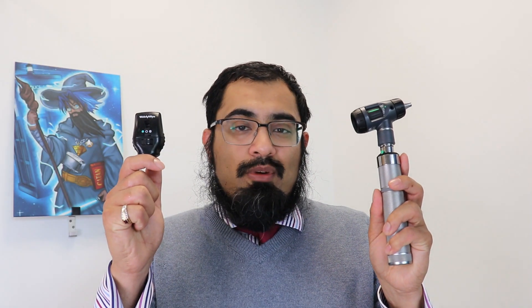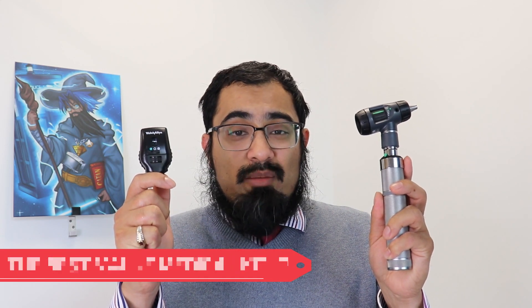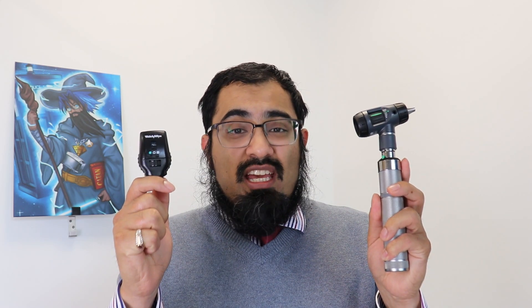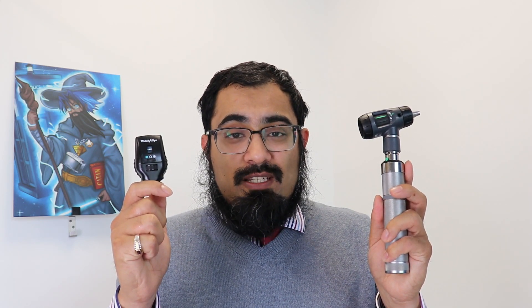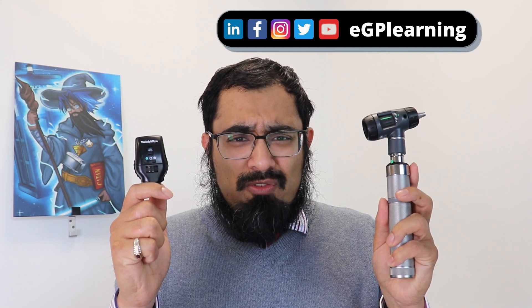The otoscope and the ophthalmoscope are easily recognised pieces of kit that most clinicians use on a regular basis. They're tried and trusted, they work, and you can need them for various parts — for example looking at ears, looking at eyes and various other orifices. Well, what if you had a piece of kit that does the job of both of them, is a lot cheaper, and has even more functions?